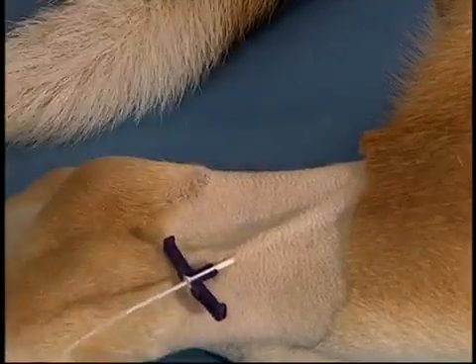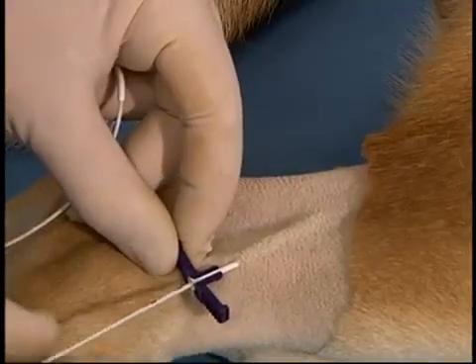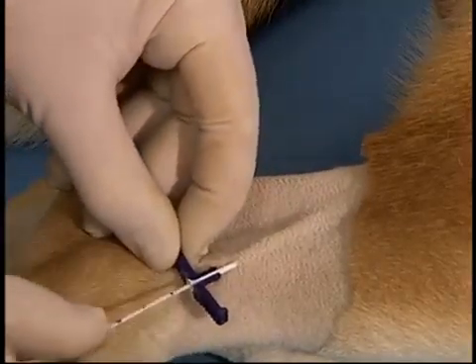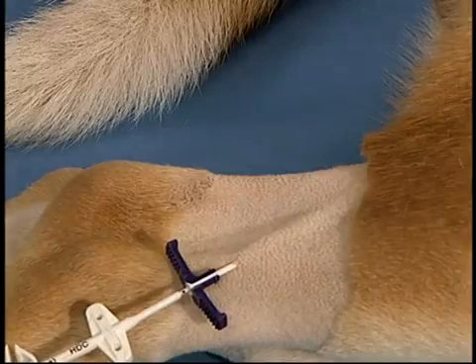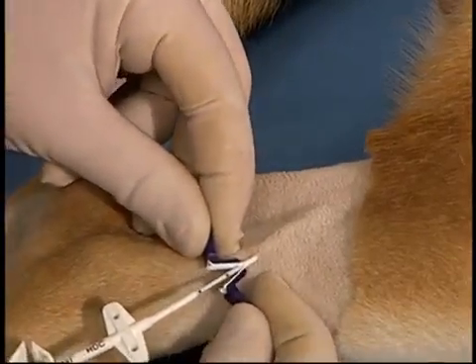The catheter is inserted to the pre-measured location. Once the catheter has been inserted, the peel-away is snapped and gently peeled off the catheter while simultaneously inserting the catheter more completely into the vein.